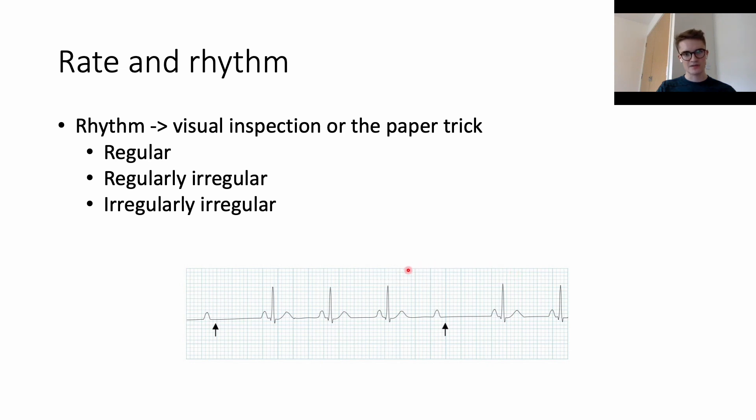That is not a regular rhythm because the distance has changed here. So then we could use our paper trick. We draw that arrow and say, okay, it actually looks regular there. Then there's a big gap and it falls off. And then if we bring it back up again, it looks regular again there.